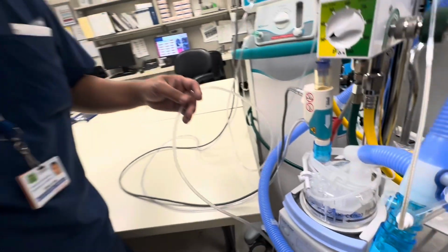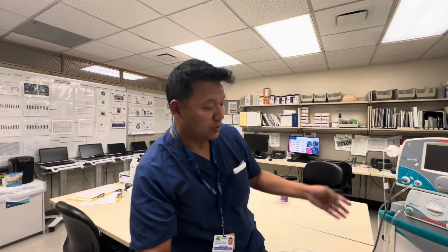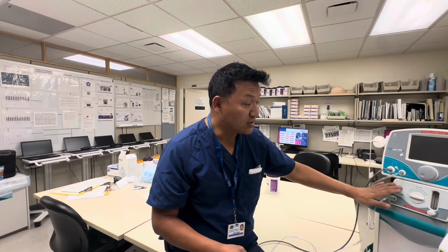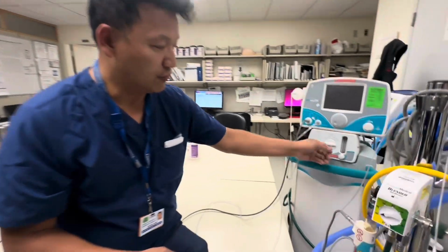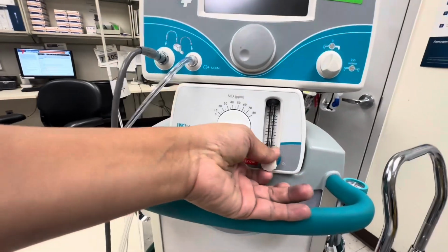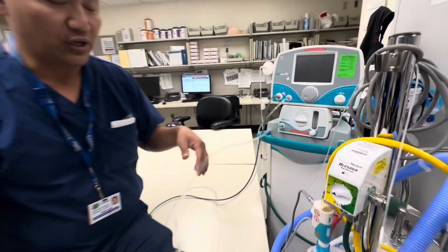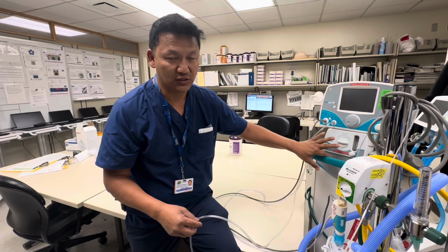We thought that would work out, or even without airvo with the nasal cannula, we could just put it on, but it didn't work out because this wasn't a blender, it wasn't blending, so we were still getting 100%. Even if it doesn't matter what flow you put, it was still reading 100%. So it wasn't really getting 28 to 30%.